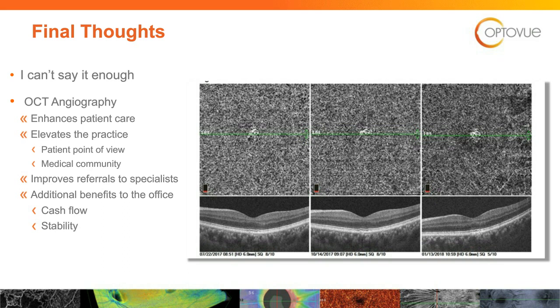So this is one where I really can't tout OCT angiography. It goes back to your traditional B scan. Now regarding drusen, you could see how the drusen create compromise to the vasculature of that radial peripapillary capillaries, and then you can see how the nerve fiber layer is compromised. So that's question number one.